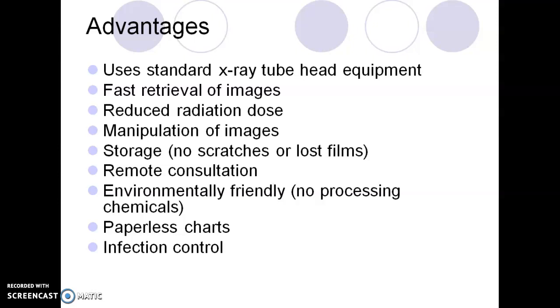Remote consultation makes it extremely easy if you are referring a patient to a periodontist or an oral surgeon. You can email, essentially, the images from the office that you're working at to the office you're referring the patient to, and that way, when the dentists are communicating back and forth, they're both looking at the same images and do a better consultation just because they have the same images.